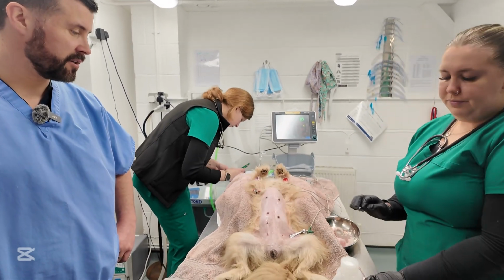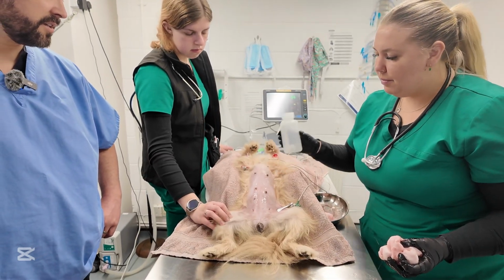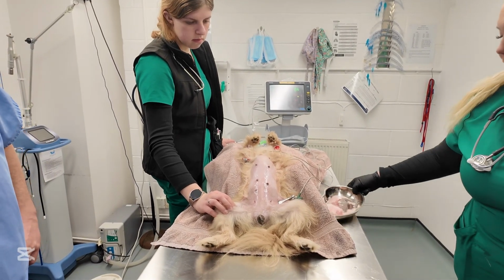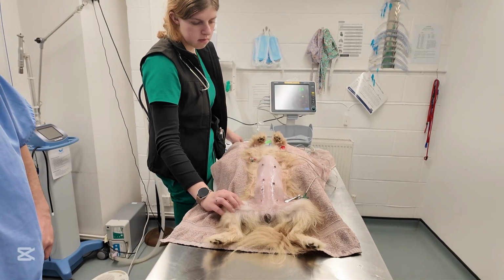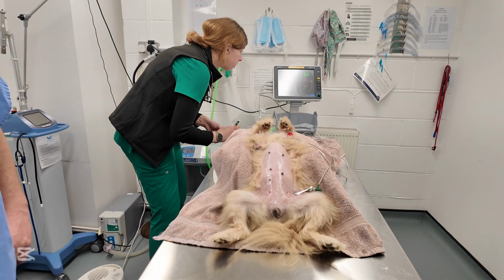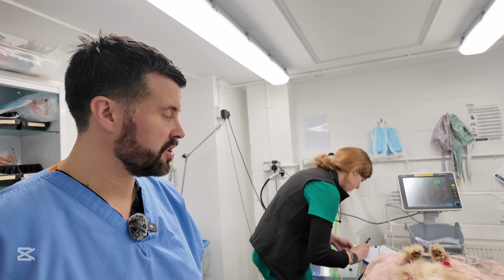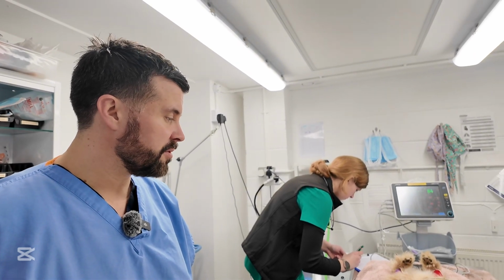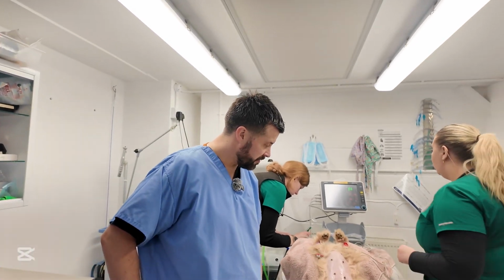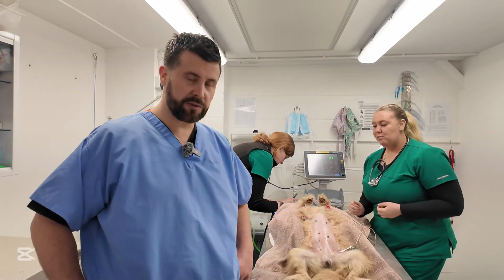So the spay we're going to do now is nice because it's a small dog, but again, still big vessels, big incision into the abdomen, so it's always a bit nerve-wracking because you're exposing the dog to infection and potentially risk with cutting those big blood vessels, but we'll give it a go. She's good to go. So I guess we'll cut to the next bit now.